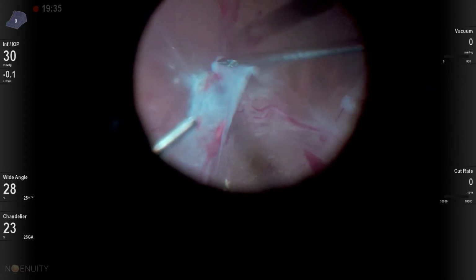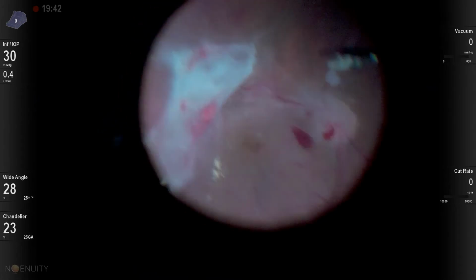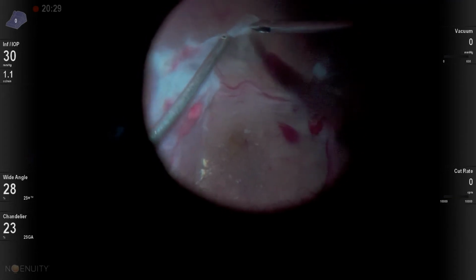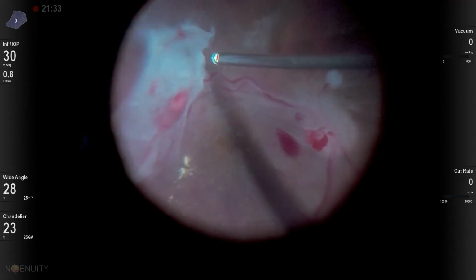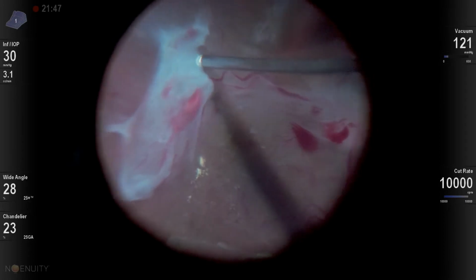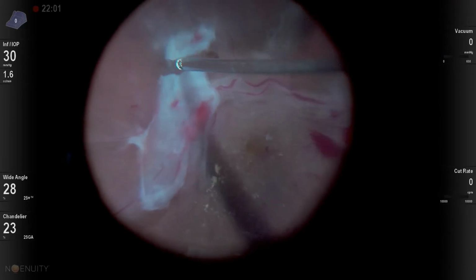Here you can see the cutter does such great work at pulling up this fibrotic tissue and cutting it right in. Here I take the tissue and I try to lay it back over on itself so I can not only pull in the plane of the retina, but I can also see what's going on underneath it. And as I'm looking at this, I'm trying to find a plane for my cutter. Here I use a little bit of bimanual technique, probably not necessary in this situation, to just create a plane there. And now I'm finding more and more areas where I can actually sever and create these islands of fibrotic tissue. And once you get them down to about a disc area or less in size, then you can just kind of attack them with your cutter at the edges.